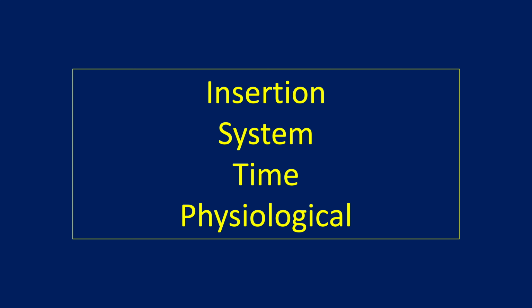These complications can be categorised into 4 different groups. Number 1, insertion related, i.e. damage to organs including the lung, diaphragm, liver, spleen and heart, vascular injury leading to intercostal vessel injury and therefore risk of bleeding, and localised pain and trauma. Number 2, drain related complications, if the drain becomes blocked or kinked, if there's air leakage causing subcutaneous emphysema, or also movement of that drain. Number 3, the risk of infection, localised infection versus deeper infection, i.e. empyema. And number 4, the risk of re-expansion pulmonary oedema.